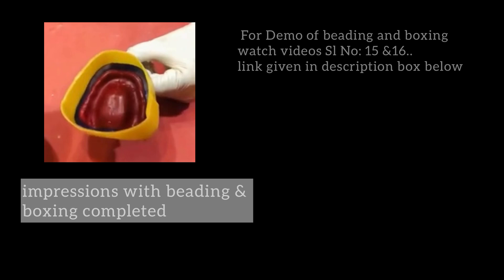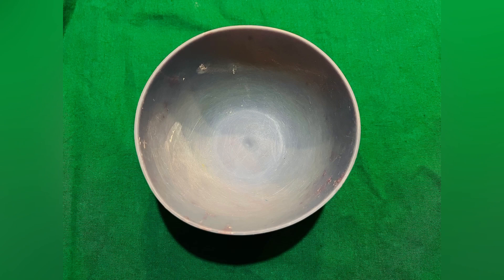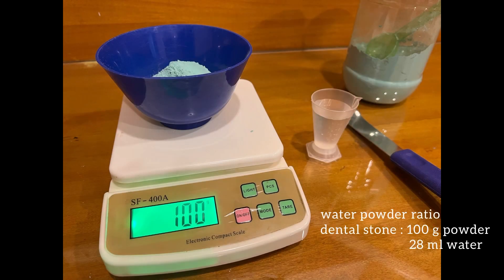The bowl and spatula used for mixing should be absolutely clean and free of any remnant plaster. Any remnants of previously set plaster can act as nuclei for crystallization and affect working and setting time.